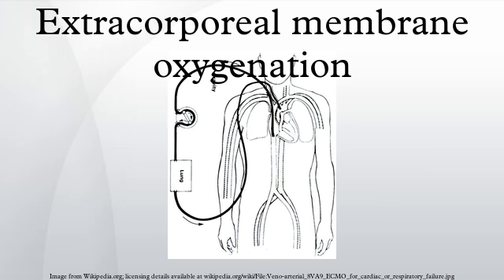Complications. A common consequence in ECMO-treated adults is neurological injury, which may include subarachnoid hemorrhage, ischemic watershed infarctions, hypoxic ischemic encephalopathy, unexplained coma, and brain death. Fatal sepsis may occur when the large catheters inserted in the neck provide a fertile field for infection. Additional risks include bleeding. In adults, ECMO survival rates are around 60%. ECMO has yet to have proven survival benefit in adults with acute respiratory distress syndrome.